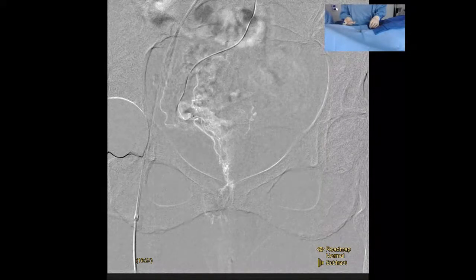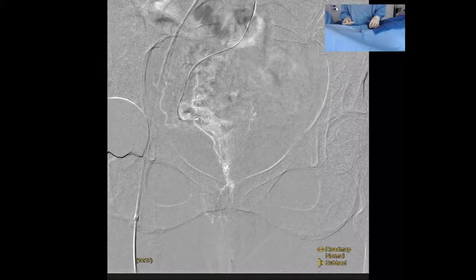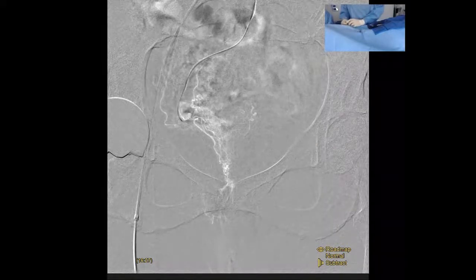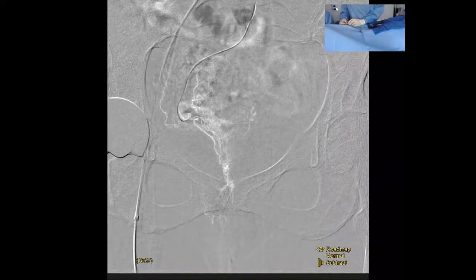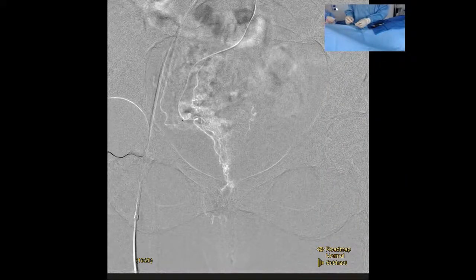I think it looks like no matter what, it still wants to go to that medial mucosal branch. Rather than have spasm, and go for something that can be more distal here, I'd say we go for a coil. So you're gonna park a coil here. Yeah, I'll take a 2 millimeter coil.